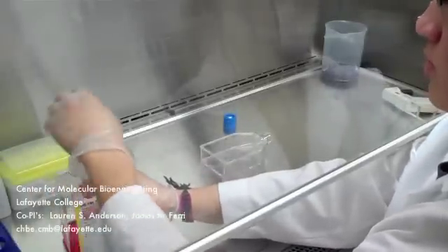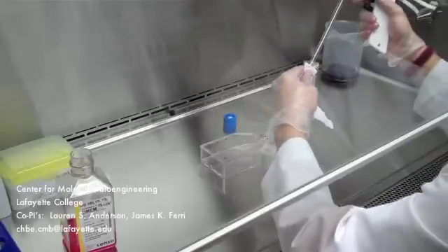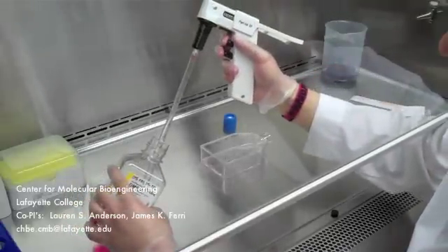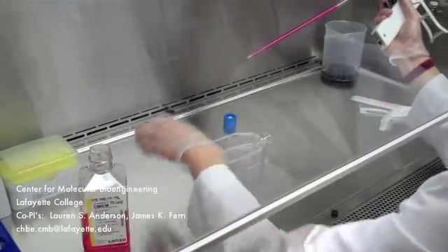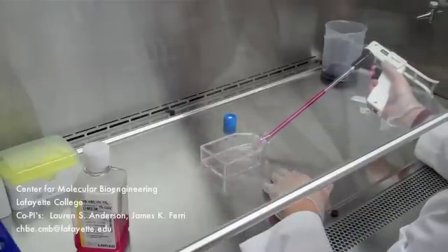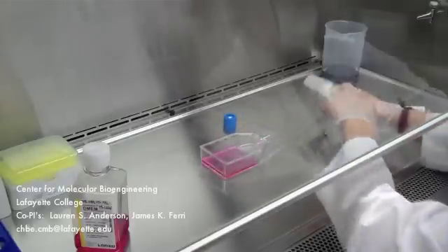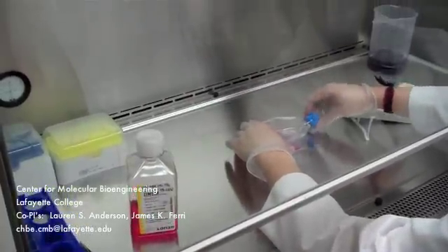Open the media bottle, attach a 10ml pipette to the pipette gun, and draw up 10ml of warm media. Place the cap back on the media bottle to avoid contamination. Release the media into the T75 flask gently to avoid disturbing the attached cells inside. Discard the pipette, place the cap back on the flask, and tighten up the media bottle cap.